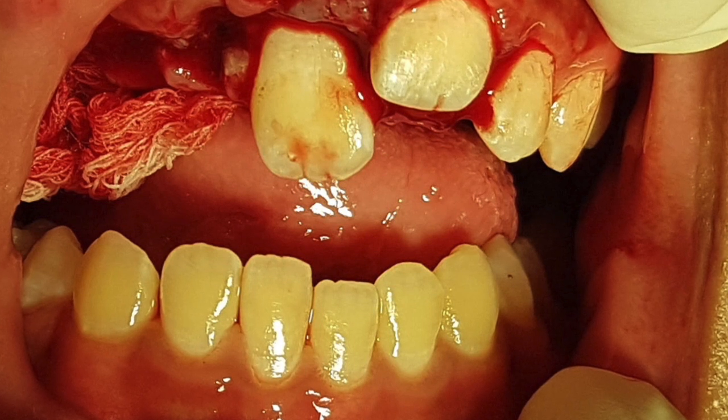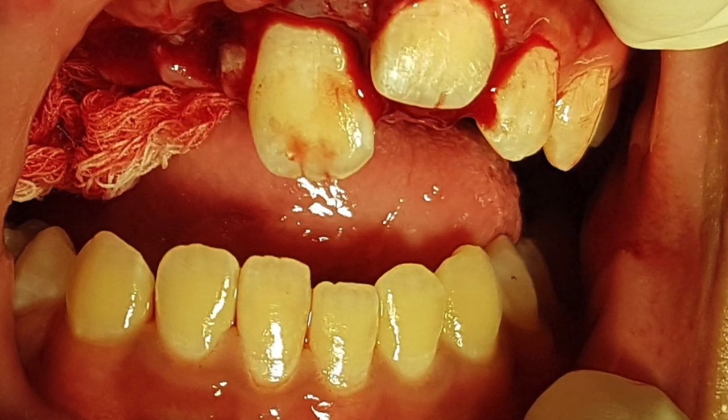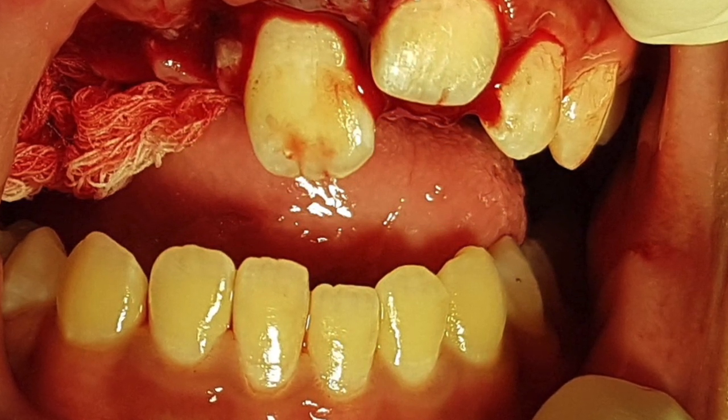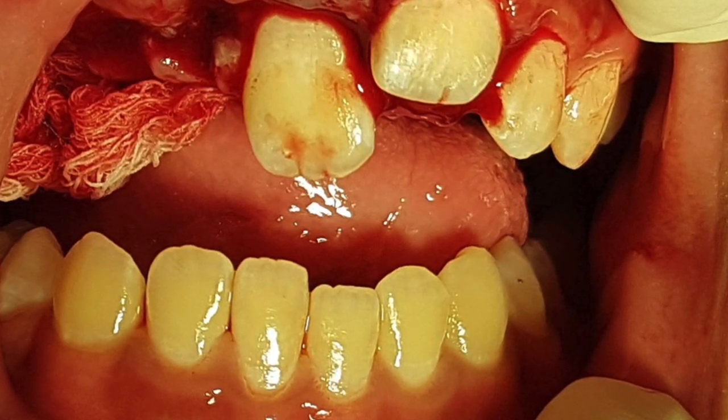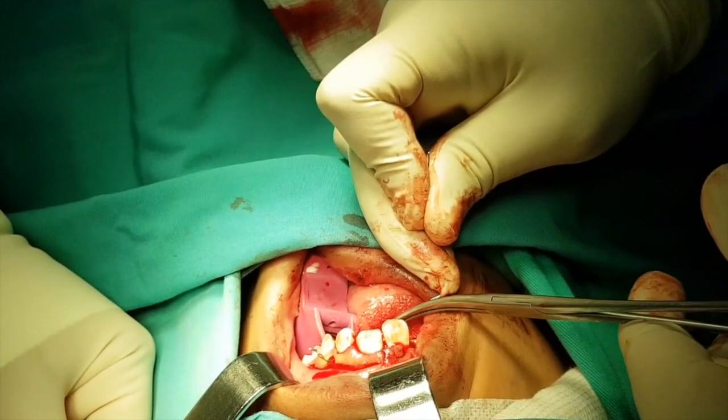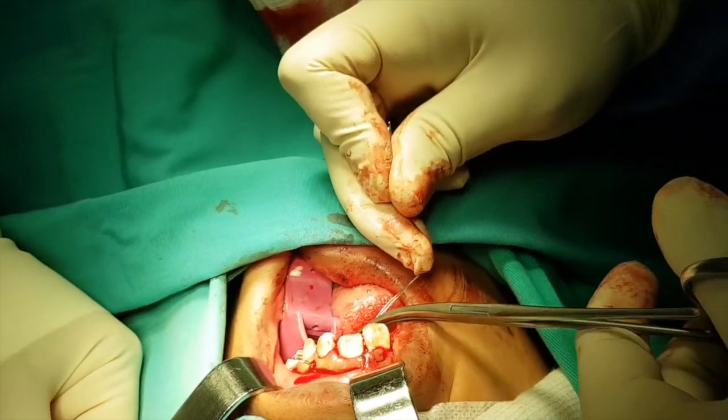At the same time, we tried to secure the right upper central incisors. We decided that we should place at least two implants to restore his dentition. So this is the time when we performed general anesthesia.